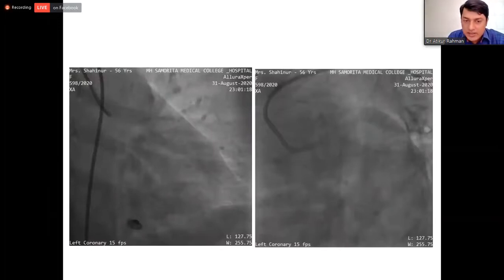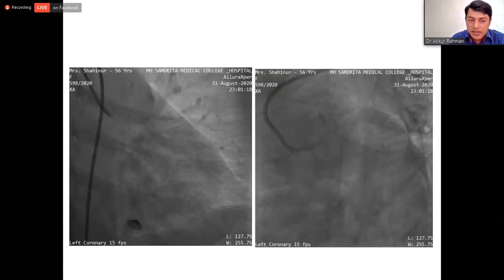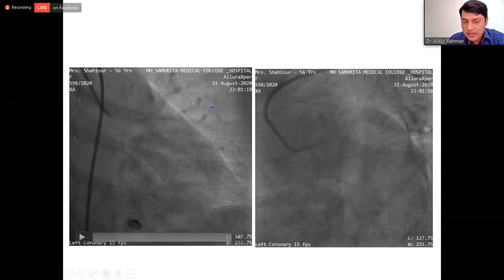The patient was decided to have primary angioplasty and we rushed the patient into the cath lab. As the culprit lesion is likely to be in the RCA, we cannulated the left main first.